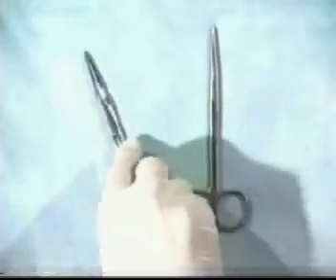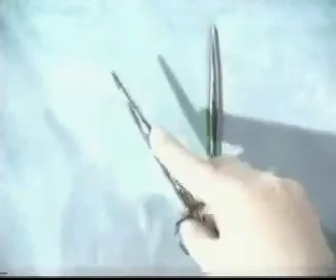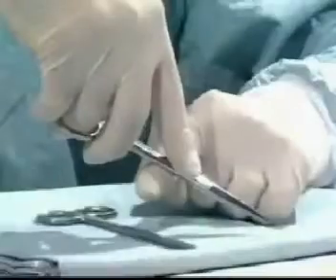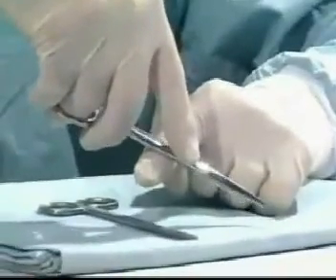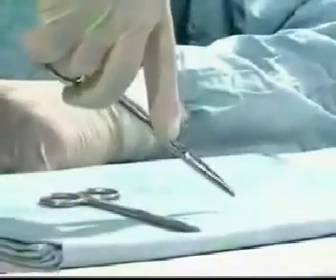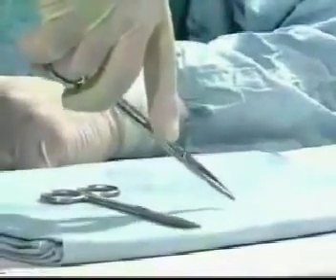If you're cutting sutures at depth, such as in the pelvis, it's often wise to stabilize the instrument over your index finger. This allows for accurate cutting and prevents tremor down a deep dark hole.